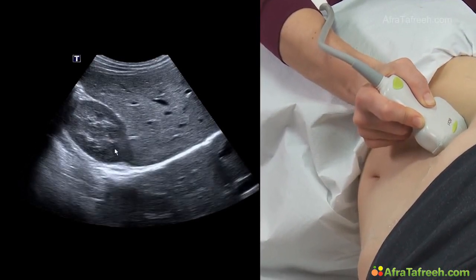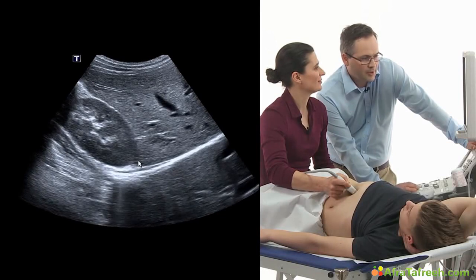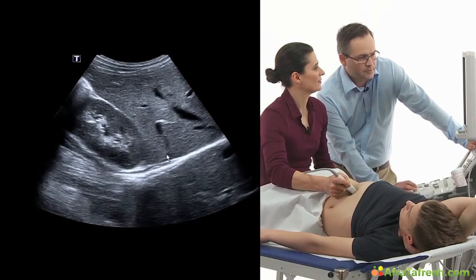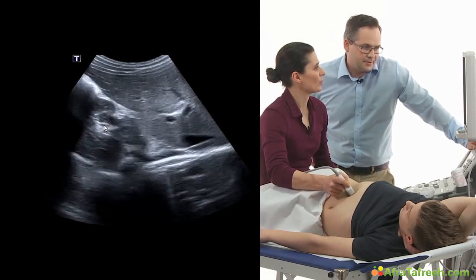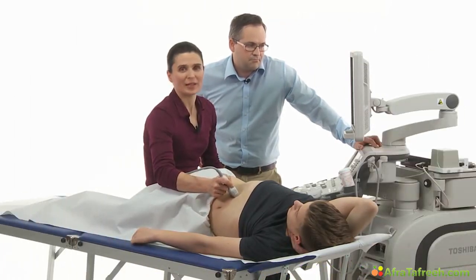And here we got another structure. The right kidney is over here. Lovely scene. Also the diaphragm. And some mirror artifacts on the other side of the diaphragm. A great picture of the right liver segment. And I proceed my sweep downwards up to the caudal rim of the liver again. Perfect.